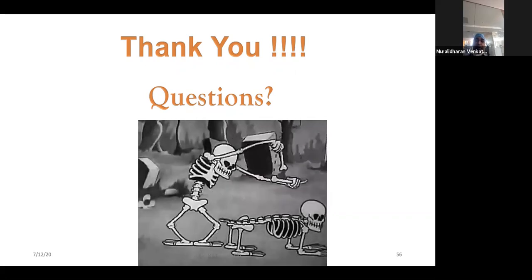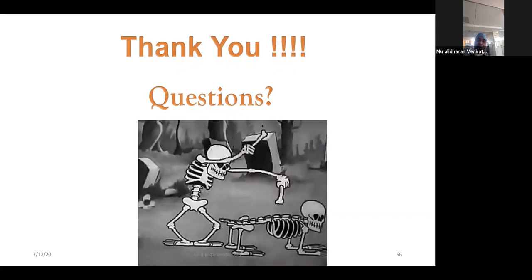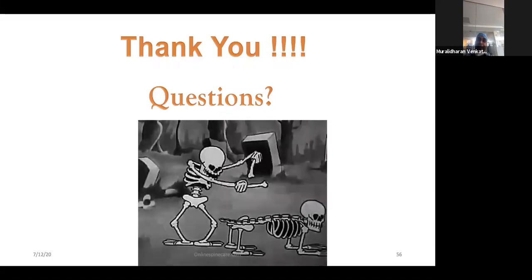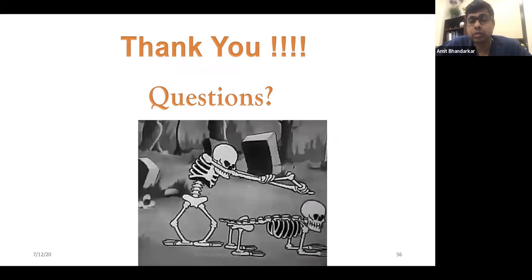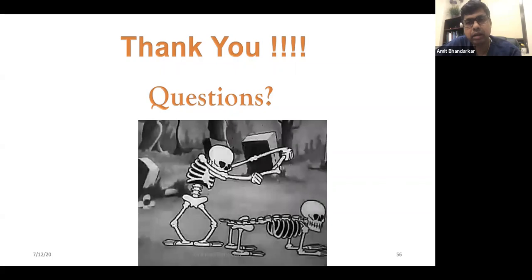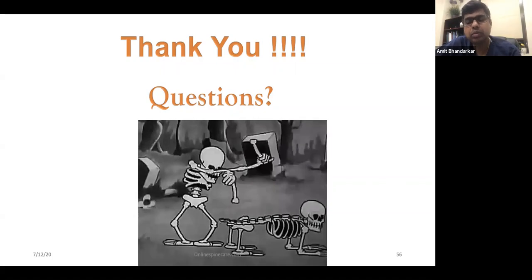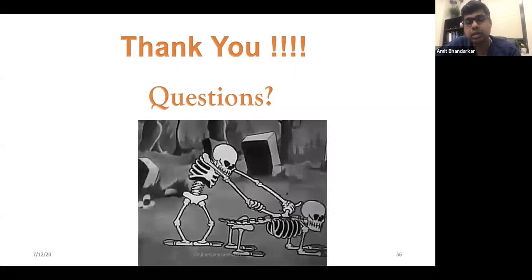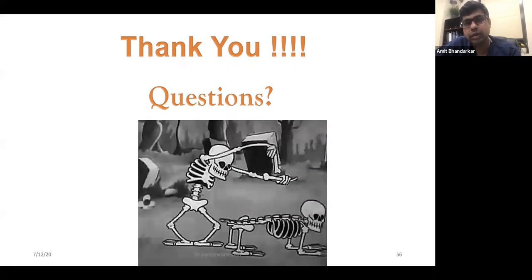A lot of people worry, so they try to keep instrumentation to a minimum in the elderly as much as possible. I think that is how our practice is. Oh yeah, I completely agree. Even I do not venture into too much insertion of cages if the patient is elderly and osteoporotic. Those patients actually do well even if their sagittal balance is positive, if they have predominant stenosis symptoms. I think they just do fine.